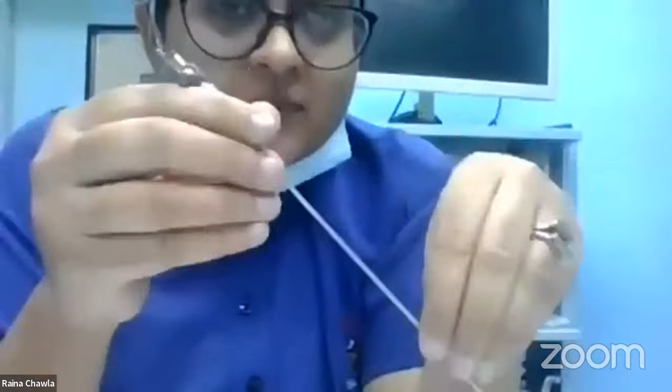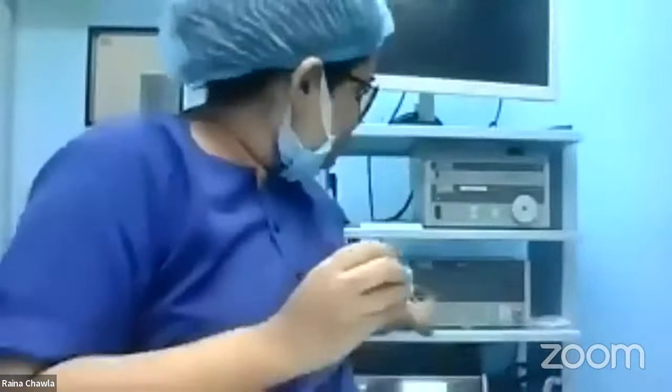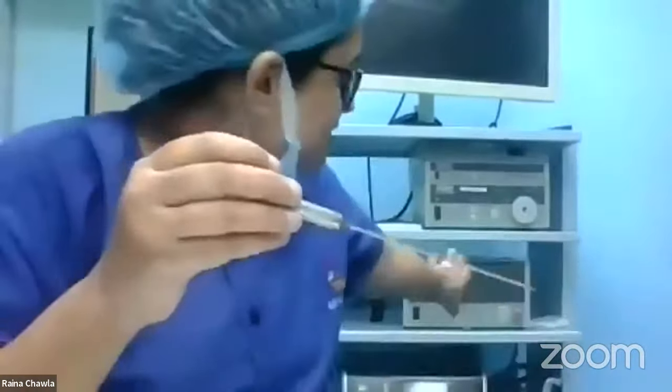Once you're inside the peritoneal cavity, you connect the tubing. From the insufflator there will be a tubing which you attach here. Once this machine is on, it will show you the intra-abdominal pressure. If you are correctly inside the peritoneal cavity, the pressure will be less than 10 millimeters of mercury. That's another sign that you're inside the peritoneal cavity. Remember, before you start the insufflation, you should not be outside, you should not be in the bowel, you should not be in a vessel, because that will lead to disaster.